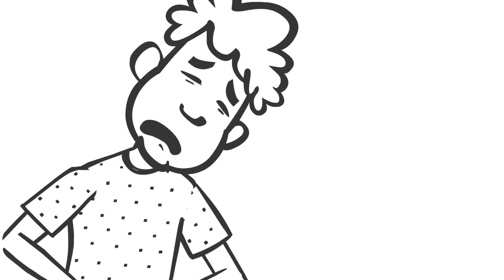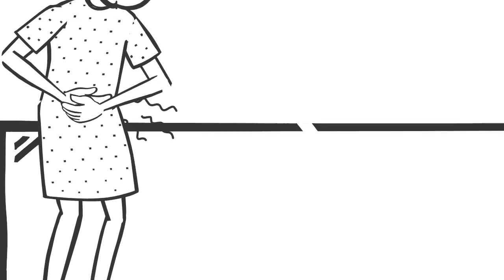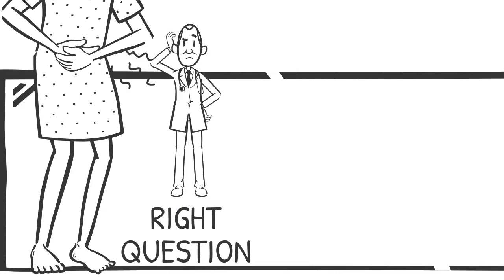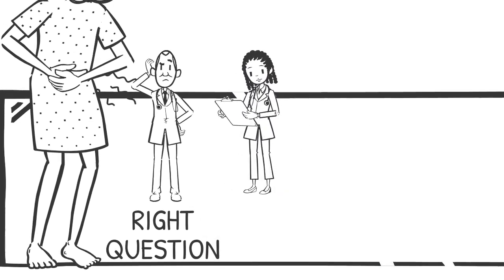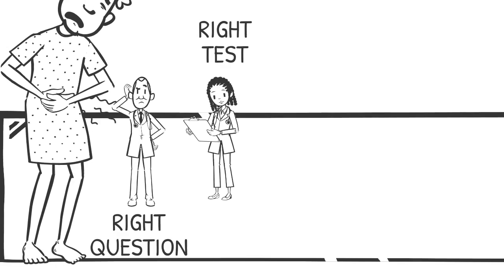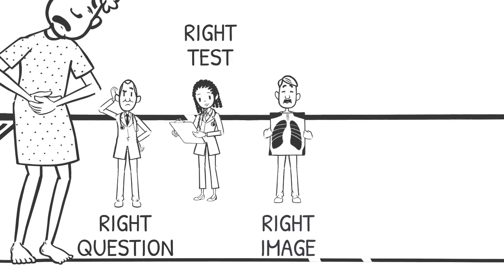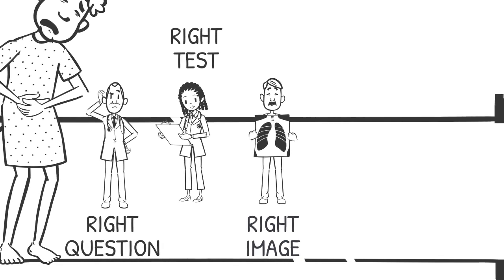At all stages in your care, everyone works together to reduce the risk as much as possible and to ensure you have your clinical question answered. As the referrer, I ensure that I have a clinical question that I need the answer to in order to provide the best possible care for you. As the radiologist, I ensure that the benefits to you are greater than any risks before I allow the scan to go ahead. As the radiographer, I make sure that the risks are minimised as much as possible and make the most of my equipment to get the information to answer your health question.